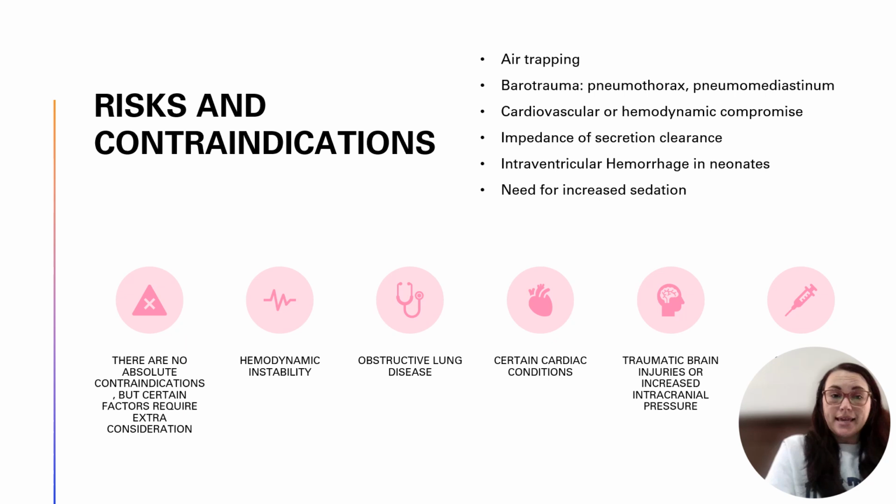All right, risks and contraindications. So there aren't any true solid absolute contraindications for using the oscillator, but there are several conditions that you need to take into consideration and weigh the risks versus benefits.